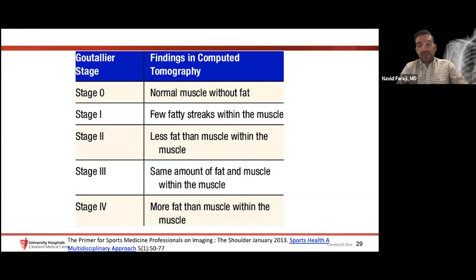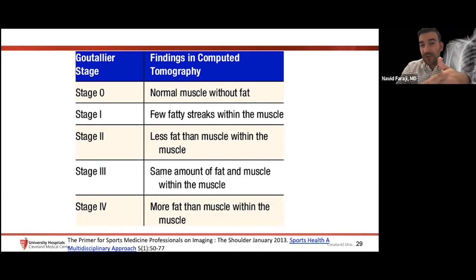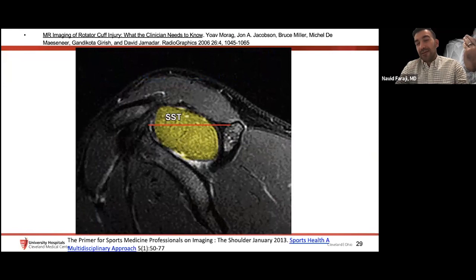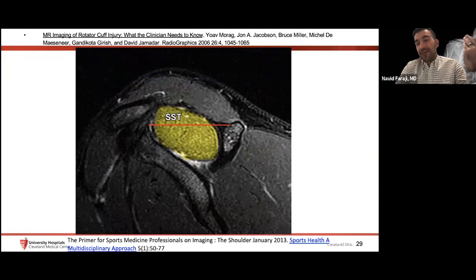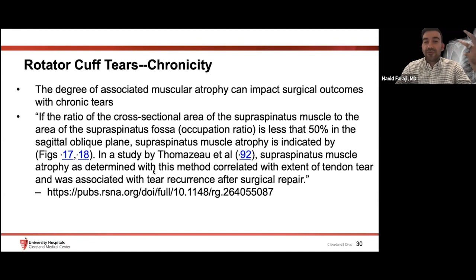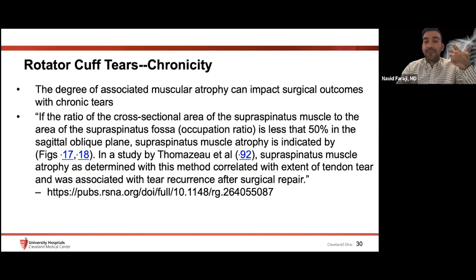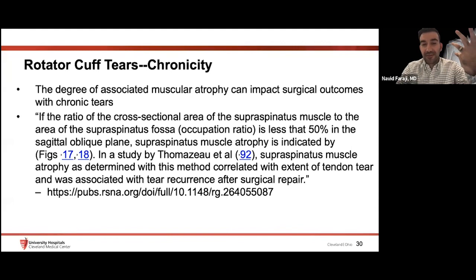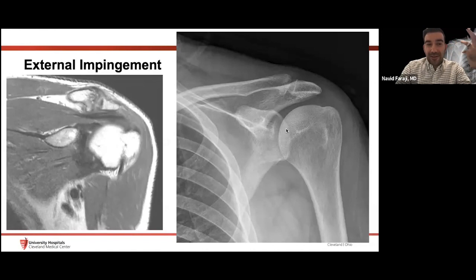For muscle atrophy, you do not want your cuff to look like wagyu — heavily infiltrated with fat. The Goutallier classification grades muscle atrophy by fat quantity relative to muscle quantity. A simpler method is the tangent sign: if the muscle does not fill the suprascapular fossa above the tangent line, that indicates muscle atrophy. There is a correlation between muscle atrophy and tear recurrence after surgical repair — if the supraspinatus muscle does not occupy greater than 50% of the fossa, that is a poor prognostic indicator for repair.